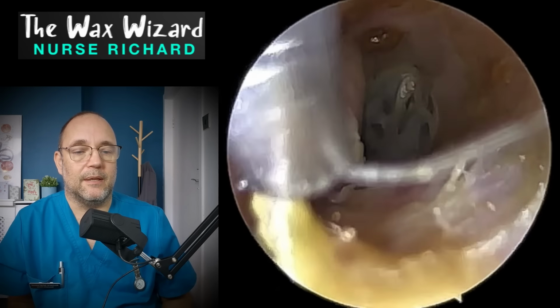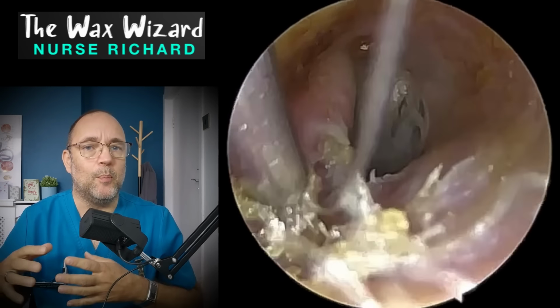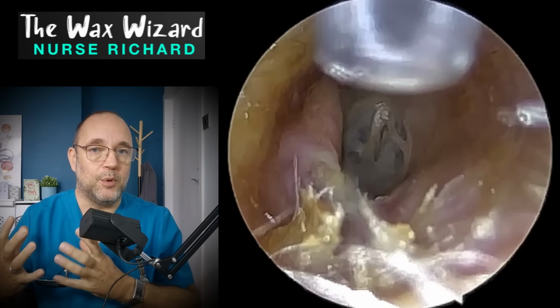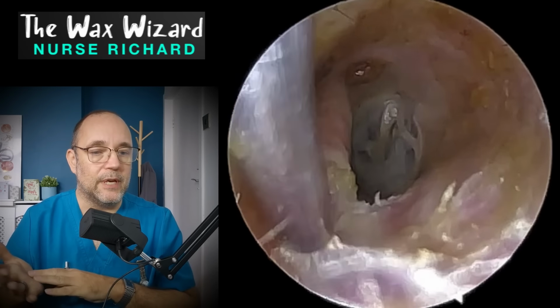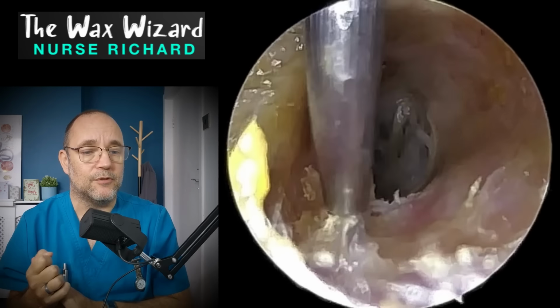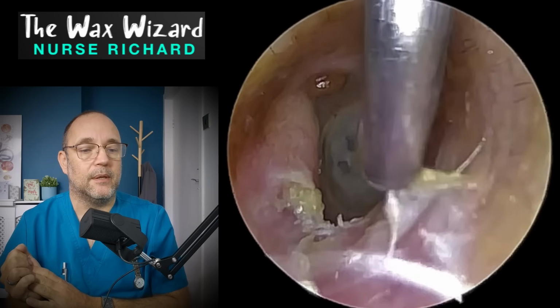So the cause of this can be from the plug of skin itself. Her ear canal was a bit bumpy, especially the other one, where it's a bit more noticeable. So has that plug of dead skin started burying downwards into the ear canal, causing a little ulceration and maybe possibly exposing some bone? That's possible. Strictly speaking, that would be a canal cholesteatoma. It's quite rare, but it does happen. Look at this lovely little peel here.